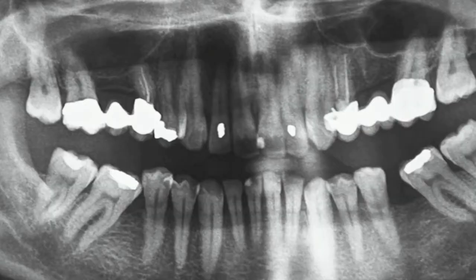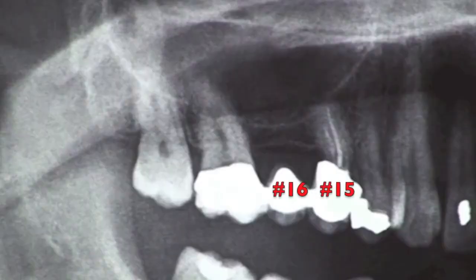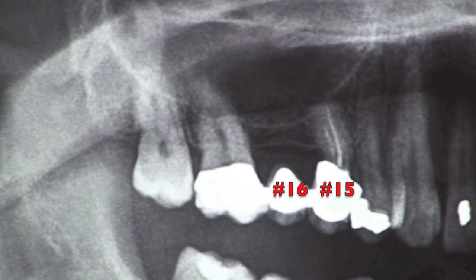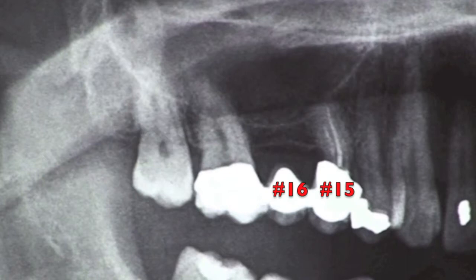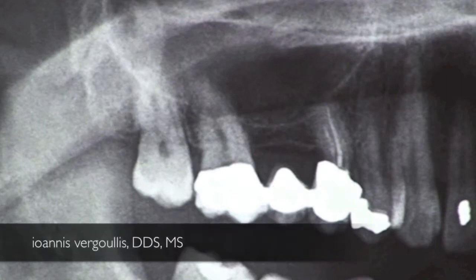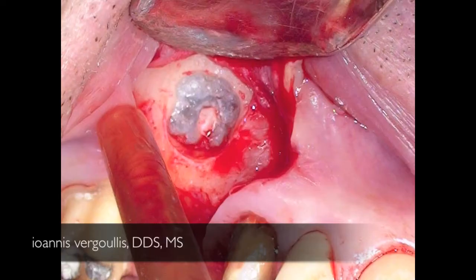This case was referred to our clinic in order to place an implant on site number 16. Since number 15, the premolar, has been deemed hopeless and needs to be extracted, we decided to proceed with the sinus lifting at site number 16, and at the second stage surgery place an implant on number 16, remove number 15, and immediately place an implant at that site.